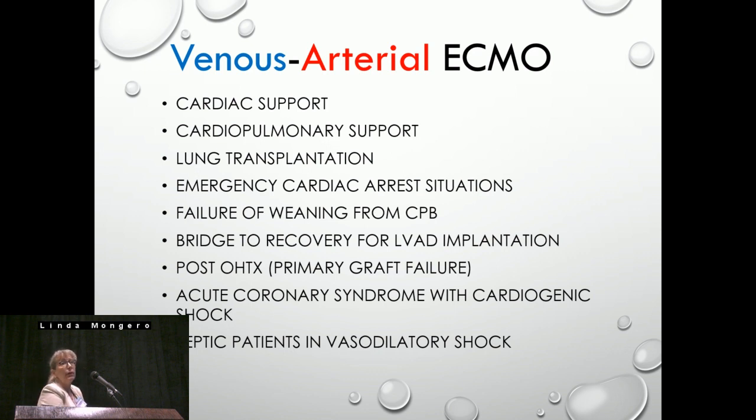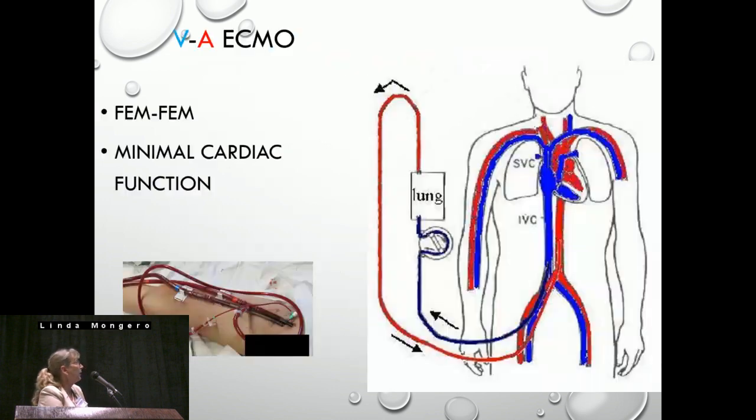And then now, again, septic patients. At one time we didn't touch a septic patient, but now in vasodilatory shock, as Dr. Bartlett explained, he thinks that it's completely worth it and should be done. It's a femoral approach here, as you can see.